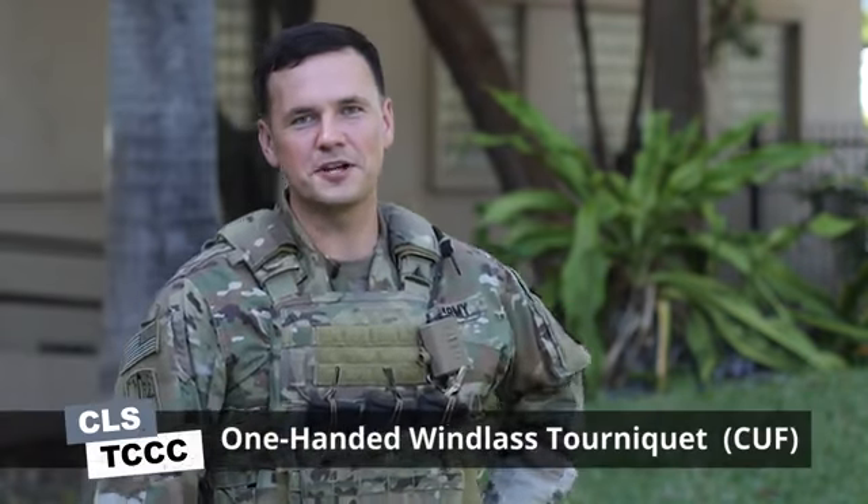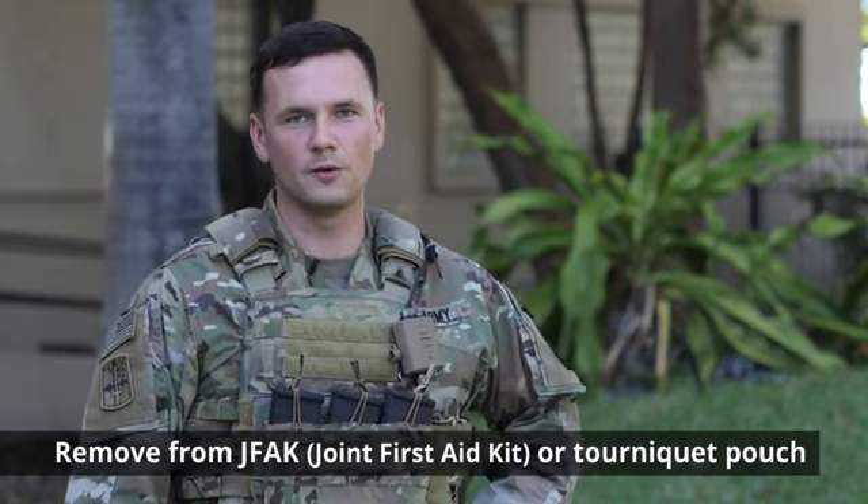Hello, Richard here. Today I'm going to teach you how to apply the one-handed windlass tourniquet in the care under fire phase. The first step to applying the tourniquet is to remove it from your JFAK or your tourniquet pouch.